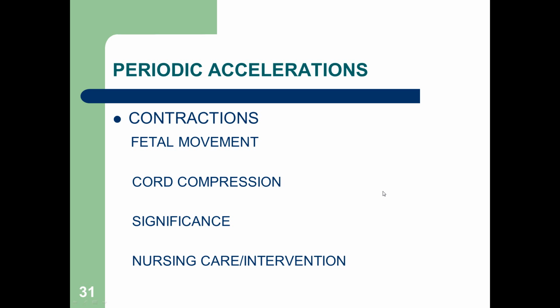Okay, some periodic accelerations. It's in response to fetal movement or uterine contractions. You may also have some deceleration, so in addition to the periodic accelerations, you may have some decels also. Hopefully, though, the baby's able to compensate as far as their heart rate goes.